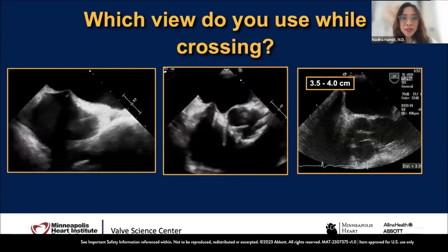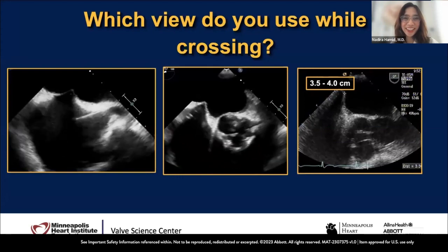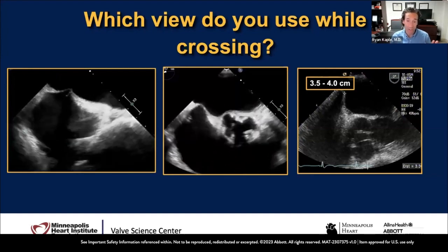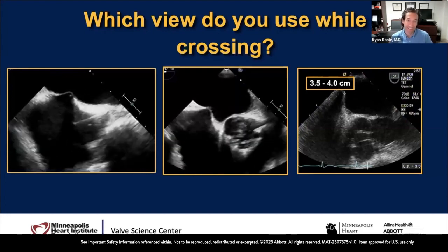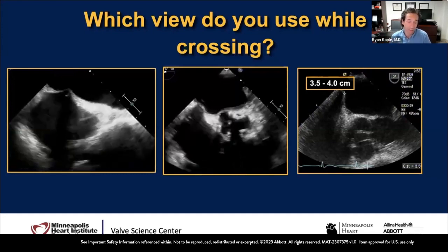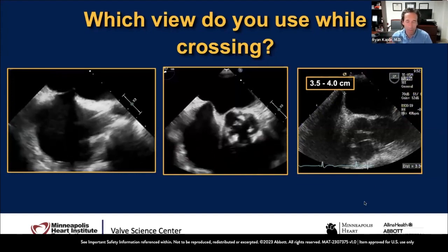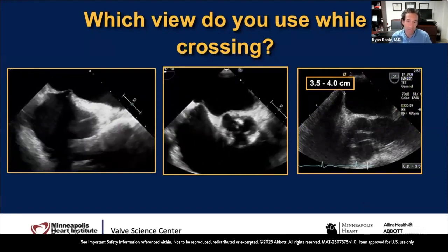Correct. And you will always ask me, the imager, can you confirm the height again before puncturing? Absolutely. And if you have to get a different position, definitely do it. If there's any question that it's not where you want it to be, start over, because aside from starting off in a safe way and getting across to the left atrium safely, you do set yourself up for success. And it's nice to spend some time on where to position the transseptal puncture. We have some good imaging to demonstrate that.